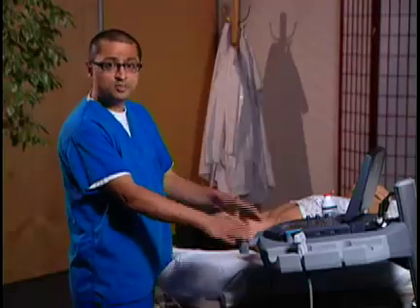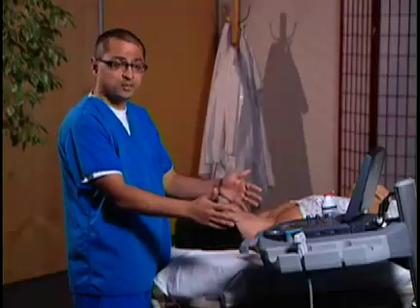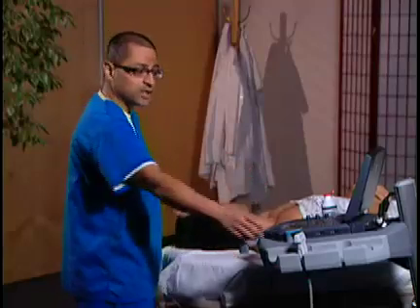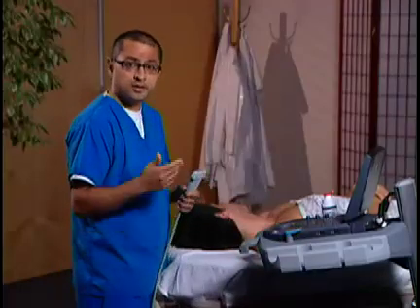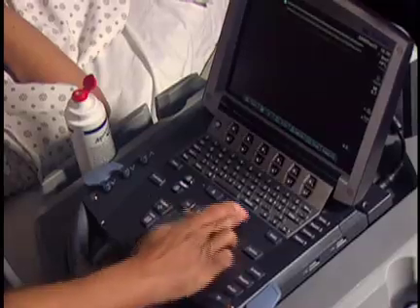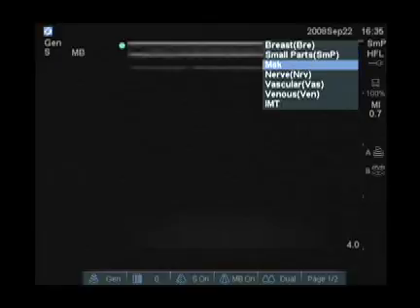We're going to go ahead and choose our system, which is going to be placed just to the right of the patient. We're going to use a linear transducer. We're going to go ahead and set up our examination type — I'm going to hit exam, click on venous, select, and we're going to be ready to start scanning.